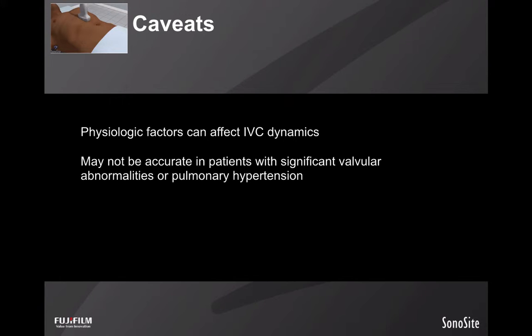So while I prioritize assessment of the tank, you should be aware of the limitations of IVC ultrasound. Any structural abnormalities that exert pressure or obstruct the IVC, such as masses or advanced cirrhosis, may interfere with its normal dynamics. Similarly, severe valvular problems or pulmonary hypertension will inherently interfere with the size and respiratory variation of the IVC. And don't forget that patients can present with overlapping shock states, which is even more of a reason to repeat your exam looking for trends.